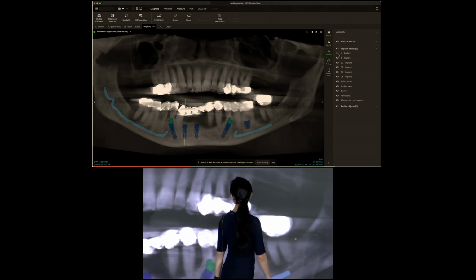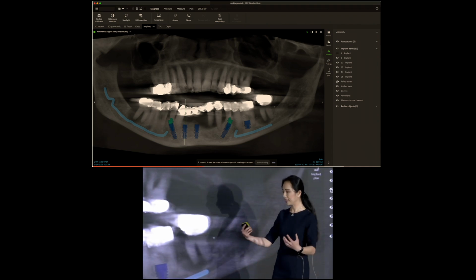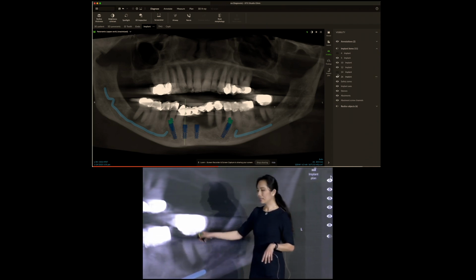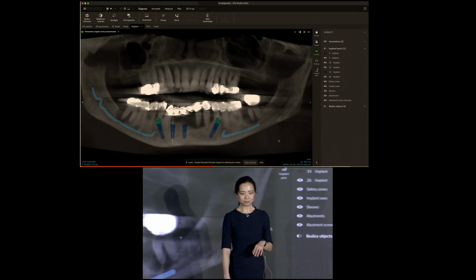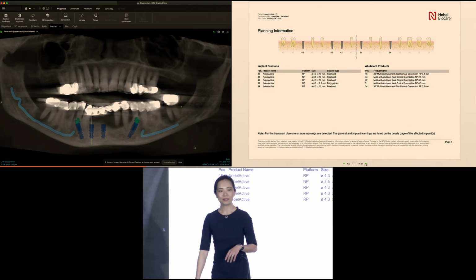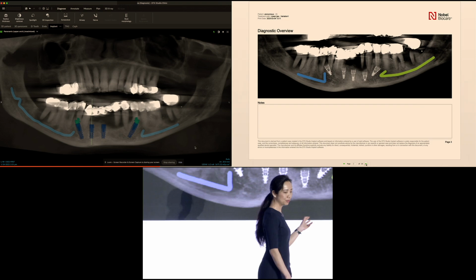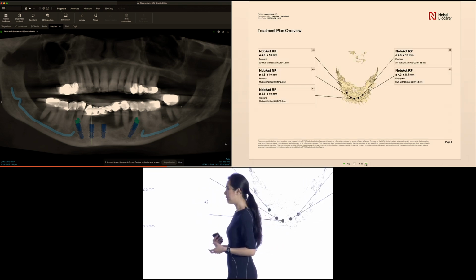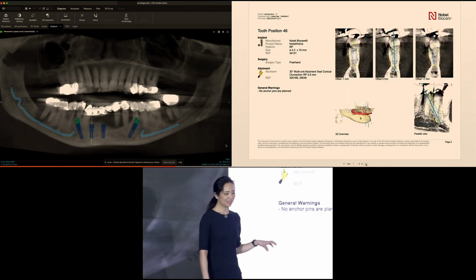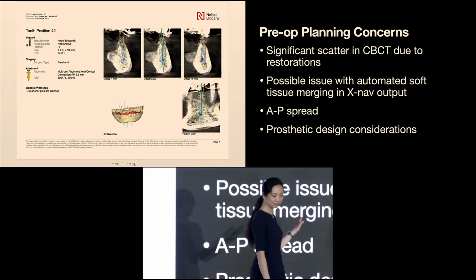So it starts off with the surgeon sending me a CBCT and also a DTX plan of where he thinks more or less implants can go. We hash it out, stick on the MUAs, determine what parts we need to order. And usually I'll do the same on my end just to see if we have consensus, and usually we do. And with this, we can actually move forward with surgery. So with X-Nav, you can export it from DTX and bring it into the hardware. So the plan will go 1-to-1.